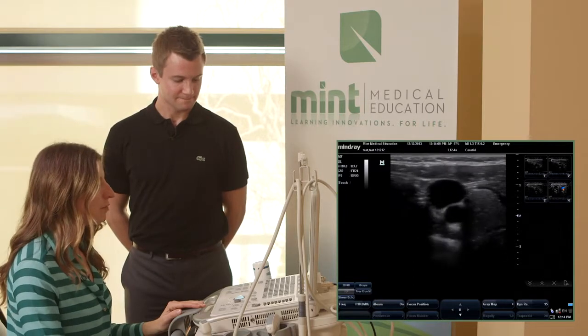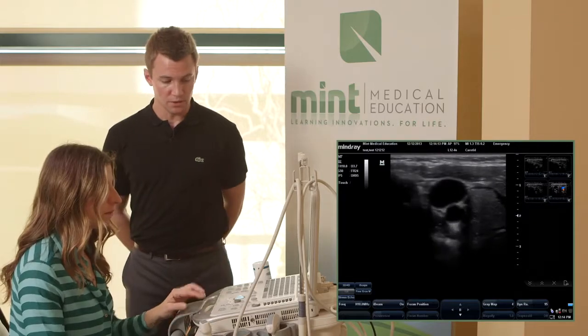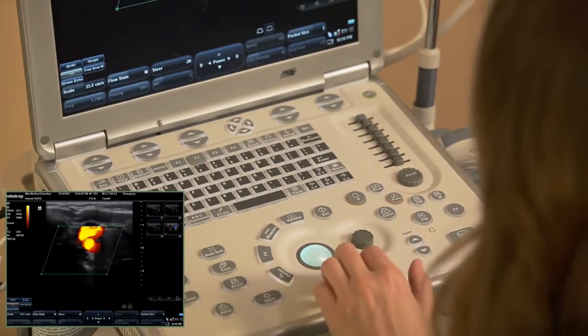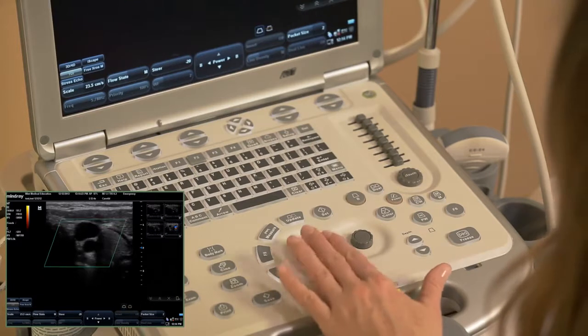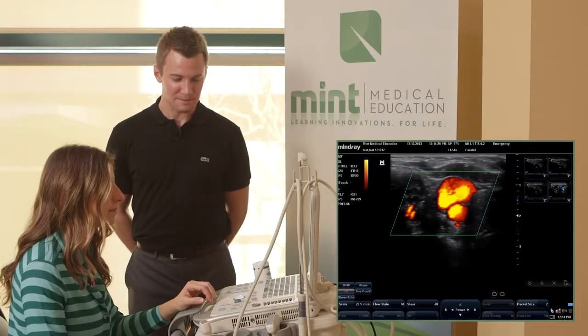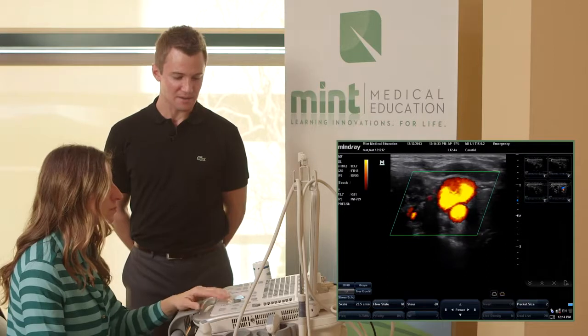Home. Do you have color power Doppler? We do, yes, and power is just below dual. Okay. Yep, and it says power. It does, yeah. All these buttons are labeled. Yes, so sometimes when you're unfamiliar with the machine, all the buttons of ultrasound machines are labeled differently and the layout's different. Right. But if you take a moment to slow down, you'll see that they're written for you.